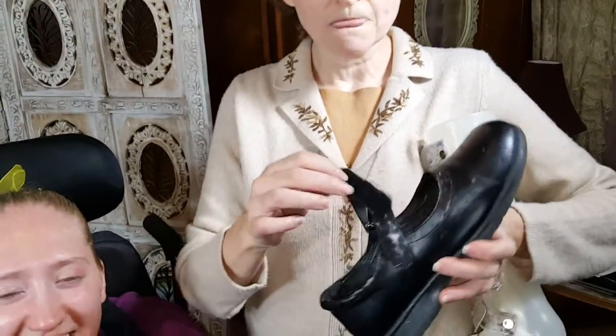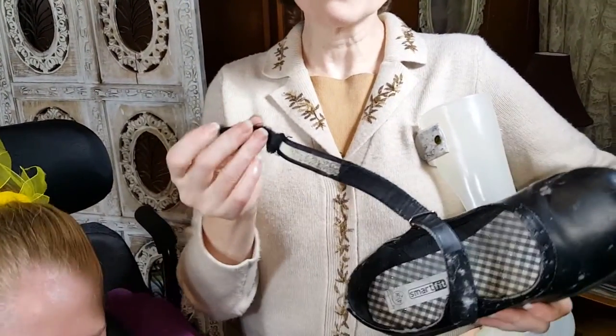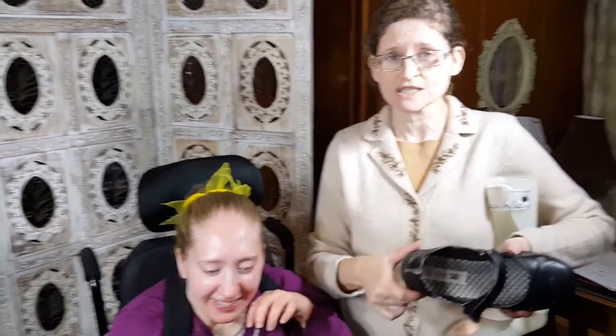She's been wearing Mary Janes for many, many years — they just work. But the velcro has been coming off, and it could have been glued back on, but the shoe was starting to slip off. It's actually been slipping off for over a month because it's just worn out. Whether she's sitting in the wheelchair moving her foot around or when we get her out and start walking her, the shoe would slip off her foot.